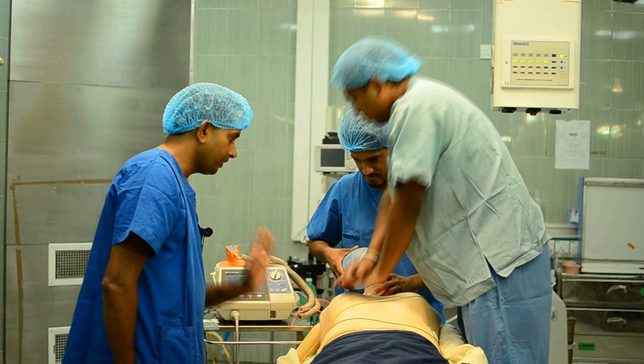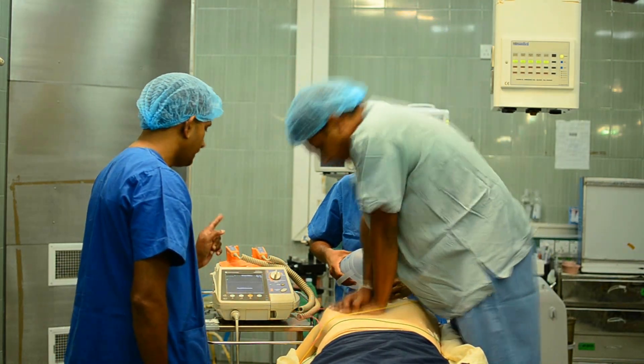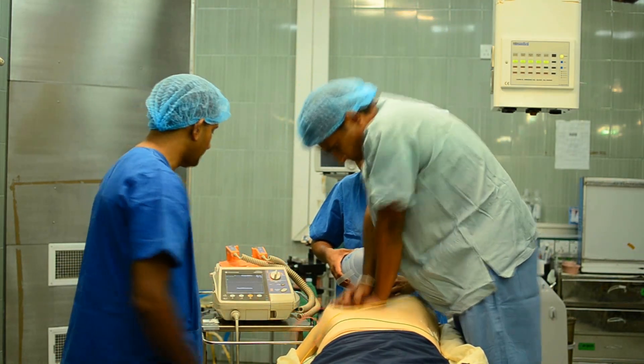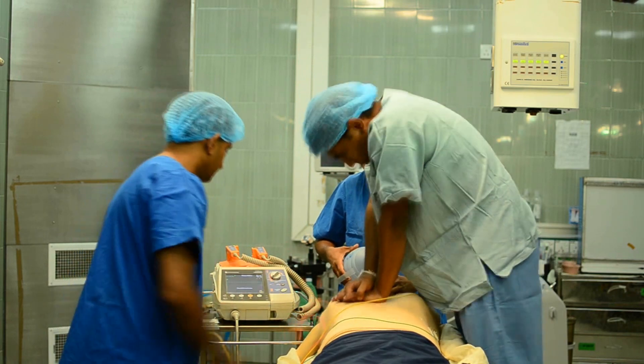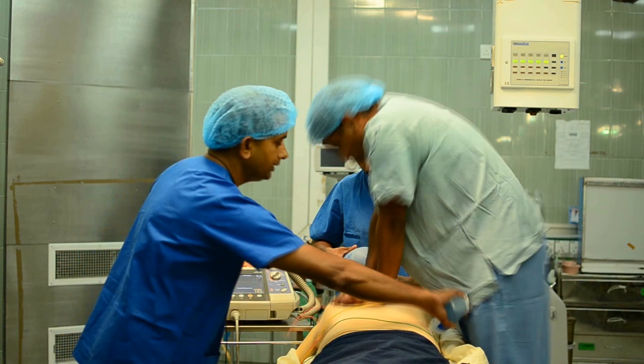Please stop massaging for a brief period. It's VF — it needs shocking. Please restart massaging and restart ventilation. Continue CPR for another 2 minutes. Selecting the energy — that is, 150 joules. Charging. Applying jelly.